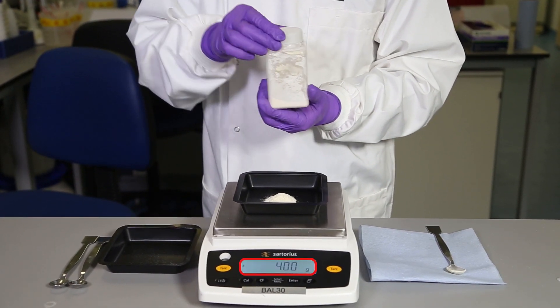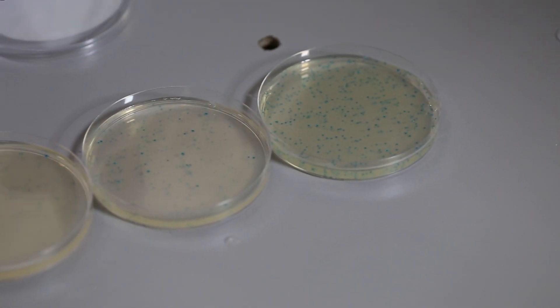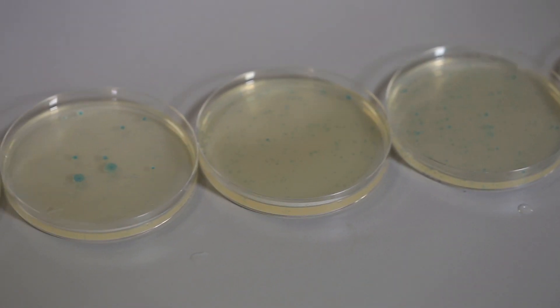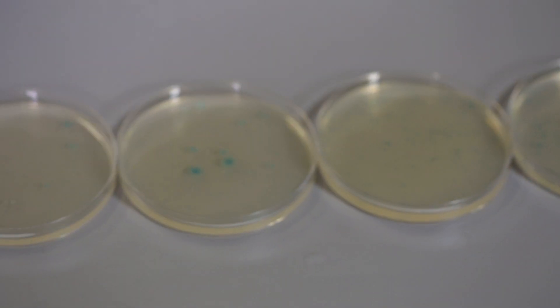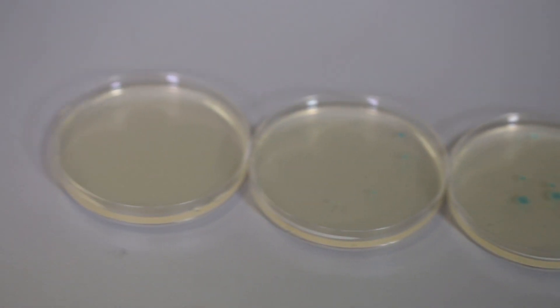Accuracy is key — over-weighing or under-weighing can be a serious problem, as once reconstituted, specific components will exist at the wrong concentration levels within the media. A good example is selective antibiotics: under-weighing can lead to a failure to inhibit flora, while over-weighing can make the media too selective, reducing recoveries.